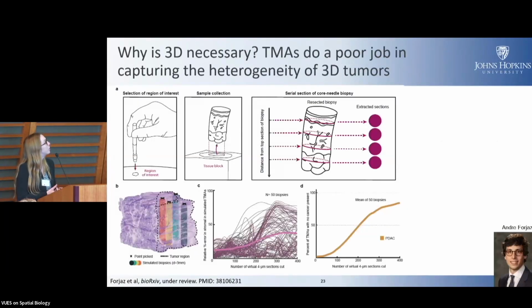But just to justify quickly, why would we want to do this? I think this will be the second talk today that someone's mentioned why a TMA is not enough. Using just the basic compositional data that we get with CODA, we ask the question: if I wasn't modeling this huge block of tissue that's the size of dice, if I was just taking a single TMA, a single whole slide image, how would my assessment of the tissue composition change? So in this specific question, we simulated a single TMA being taken at many angles in the same block of tissue, and we estimated what would be the malignant cell composition in each of those TMAs, and how many of these TMAs would I have to take, almost how many independent biopsies would we have to take to get a holistic sense of what's actually going on in the tissue. And what we found is it was shockingly many. To get to the actual composition, you needed almost thousands of individual slices.